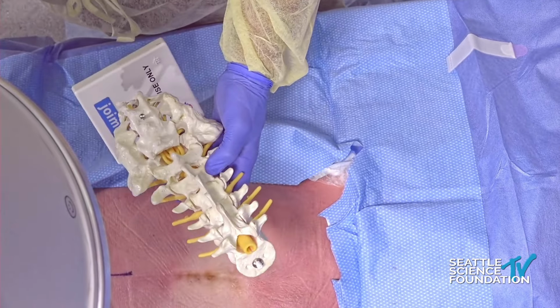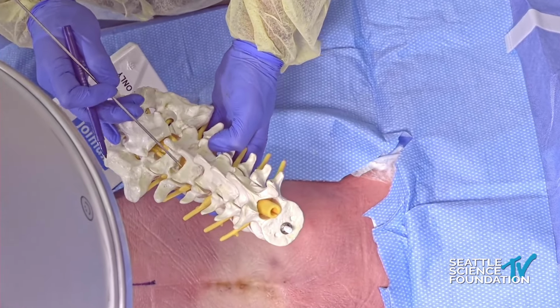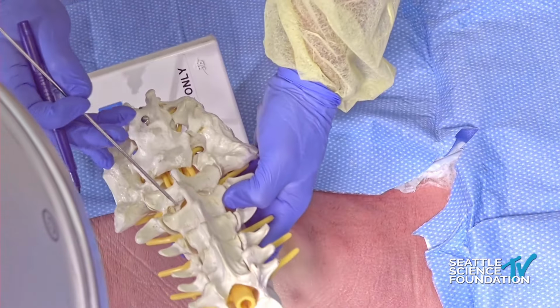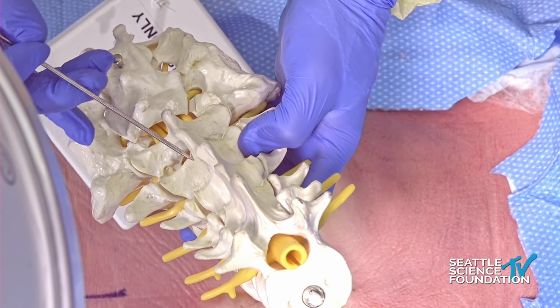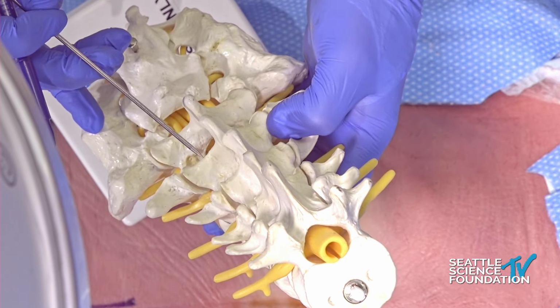But over here, our principal anatomic landmark is this inferior medial edge of the lamina, if you guys can see. I'll turn it there, yes. So essentially, depending on who's doing it, you can pick a lot of different areas in this interlaminar window. Generally, I like to pick this area right here.